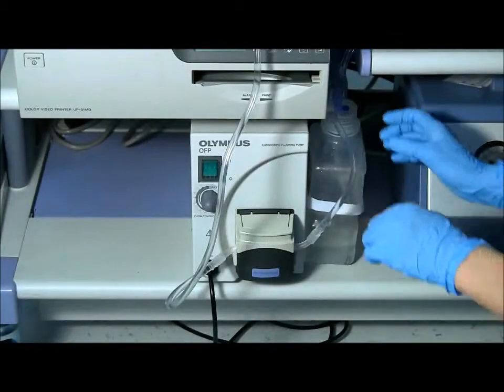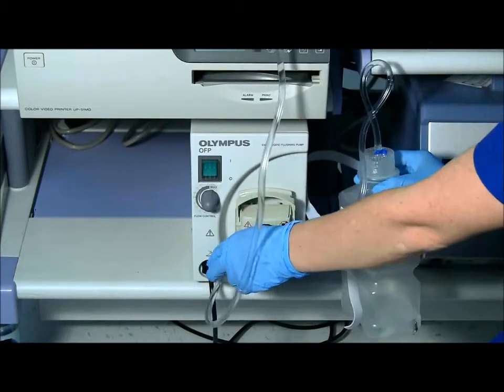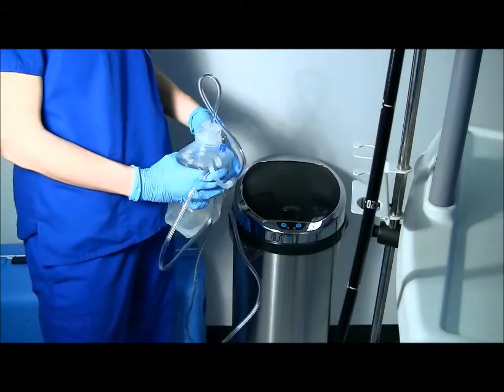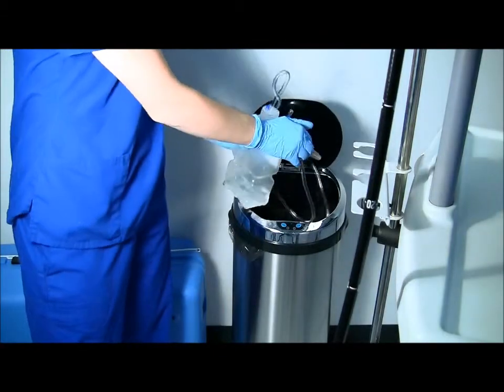After you are finished with all of the procedures for the day, unhook the water bottle from the velcro strap and open the pump head, removing the tubing. Making sure it is disconnected from any scope, take the entire system and discard it appropriately.